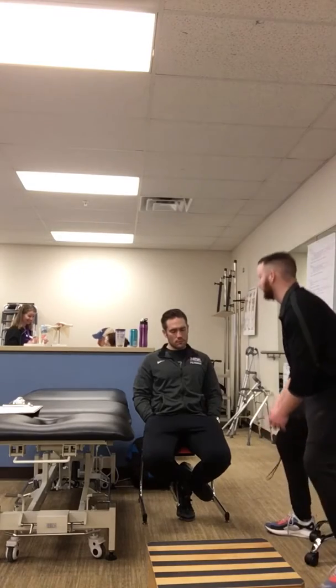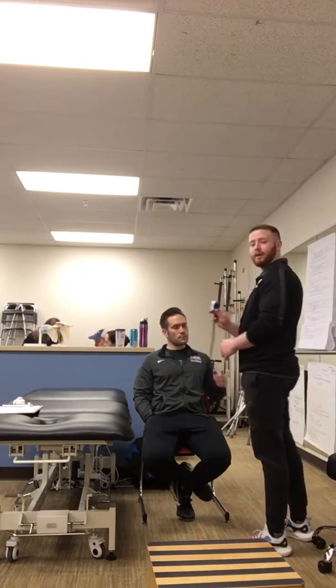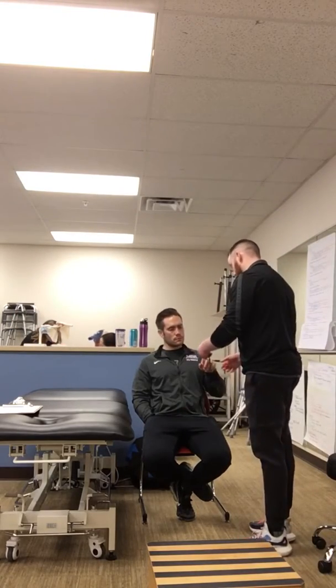Measure for a minute, for skill check purposes. I will say use that 14. Like I said, you're going to look for that chest wall expansion, seeing how many breaths he takes within a minute. So now, while you're at rest, I'll get his pulse and his oxygen.